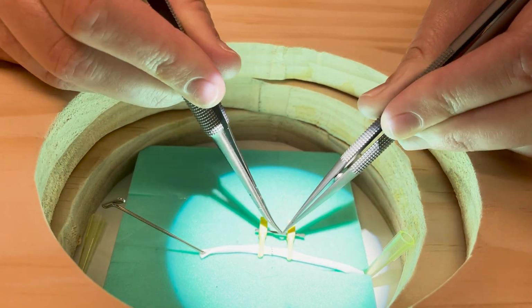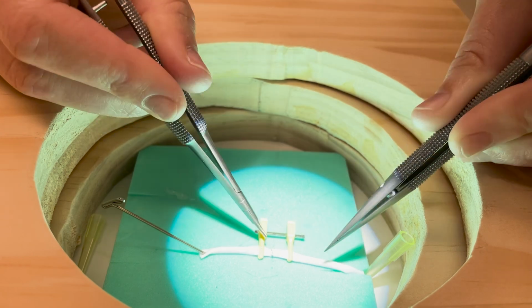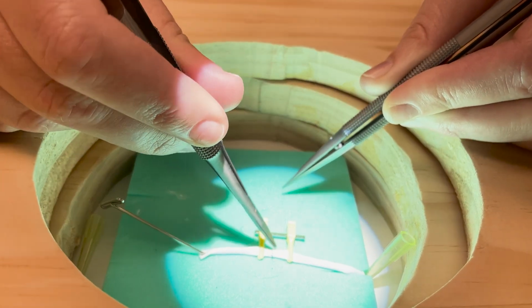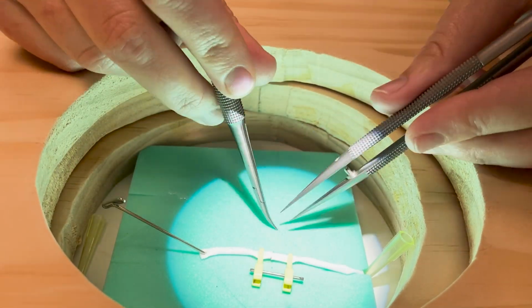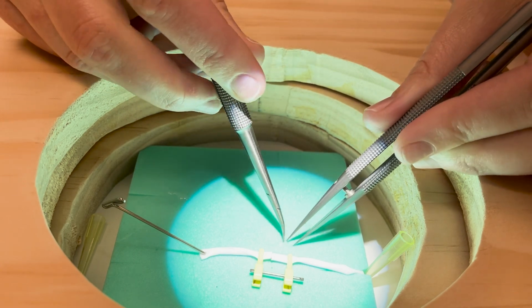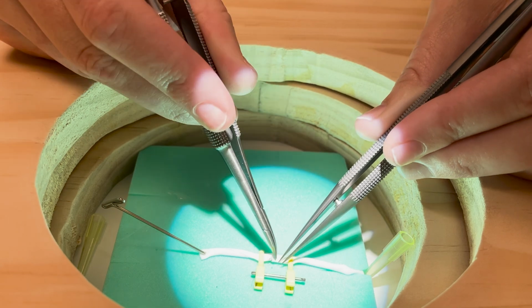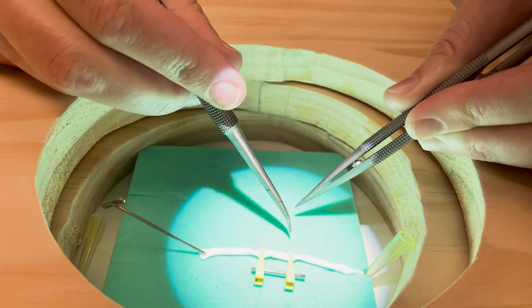Our program also prefers a surgeon's knot for the initial knot of bisecting 180-degree sutures. 3 knots are tied, and the suture ends are trimmed with micro-scissors. The placement of the second bisecting 180-degree suture is the most critical suture placement for spacing of anastomotic sutures.